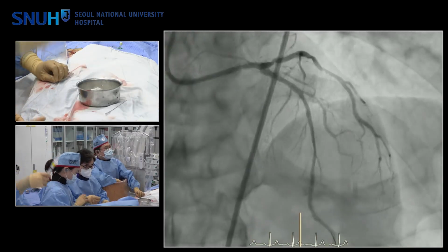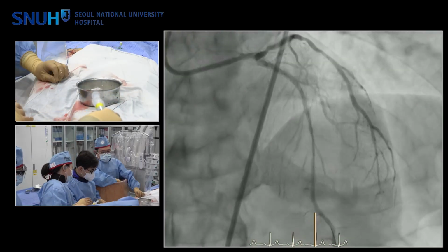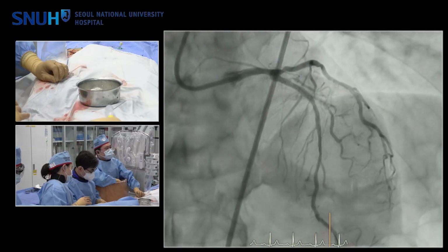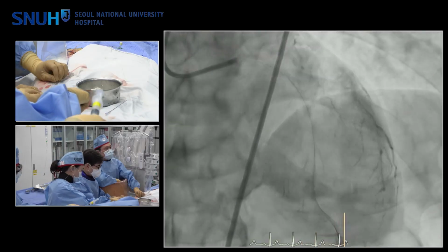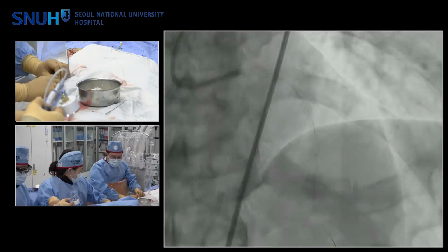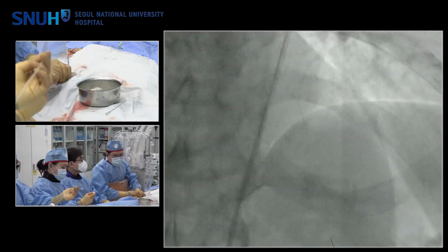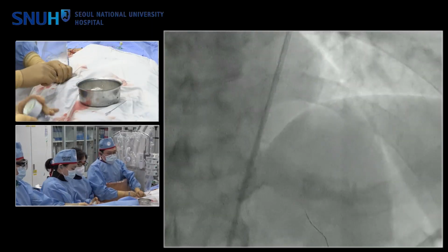Thanks. So actually, calcific nodule is the most difficult lesion to treat, and even with the rotoablation, we found that this is very difficult to treat, calcific nodule, even with the IVL. So what's any experience for the treatment of calcific nodule with IVL or rotoablation, which is complete or still way to go?